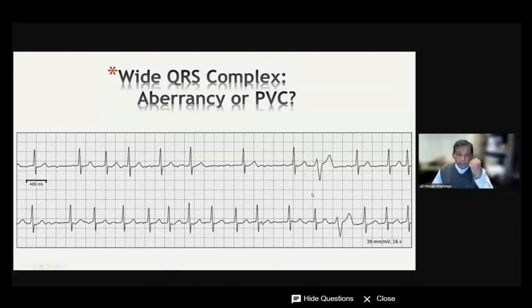If you see a typical bundle branch block pattern, it's probably coming from the atrium. If you see a fixed coupling interval, it's probably from the ventricle. And just because you see long, short intervals, it doesn't mean it's always Ashman, like in this case. So you look around and you see there is a similar beat without long, short, and this has to be connected with the fixed coupling interval. This has to be a ventricular impulse.